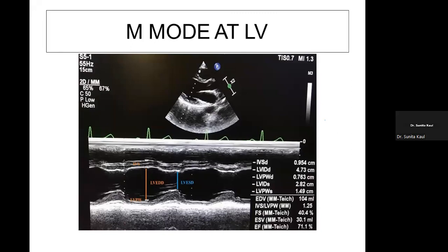Hello. Wait, I lost you totally. Yeah, it is the most downward systole, because this is the end systole, the minimum volume. So can you also see for the most upward movement of the posterior wall also, ma'am? Then you can see in that way also.